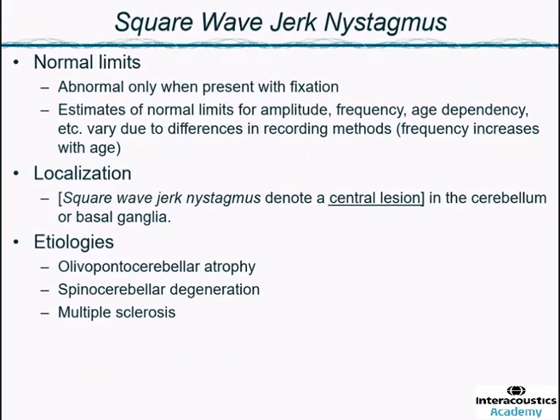There's one paper that has a nice description of these involuntary eye movements and their normal limits. We'll put the reference to that in the follow-up to this webinar. But generally, if you see just a few beats over a 1 minute period, you should be cautious about calling that abnormal.